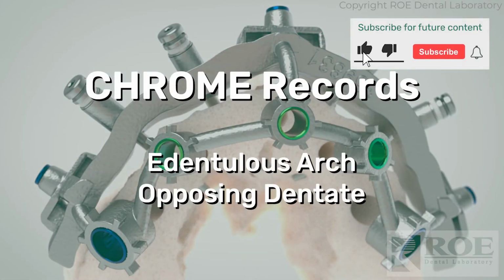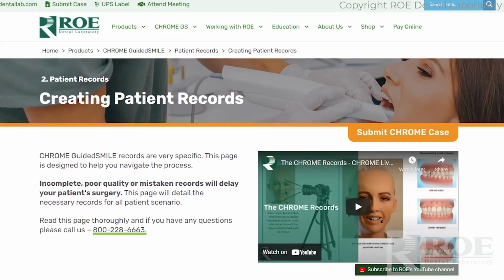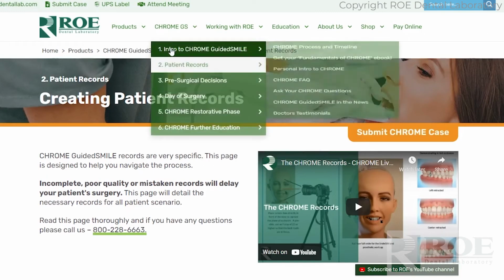This video will describe the chrome records for a single edentulous arch with an opposing dentate arch. The edentulous arch will be the surgery arch. And as with all of our chrome records for all the different treatment options, the checklists are found on our website under Chrome GS, Chrome Patient Records.